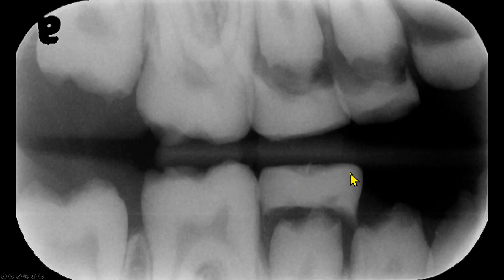The occlusal surfaces of the deciduous molars are flat. The cusps of the unerupted premolars are very pointed.